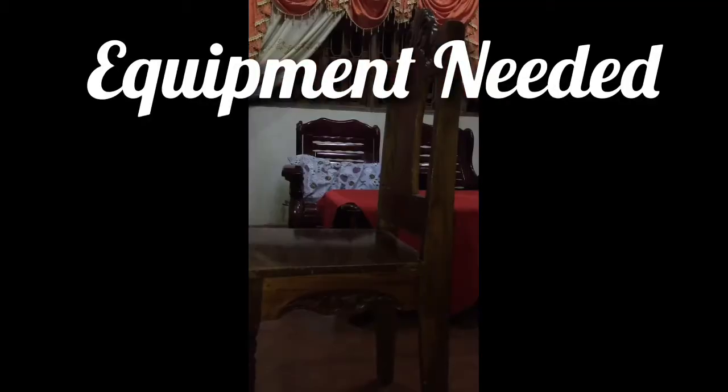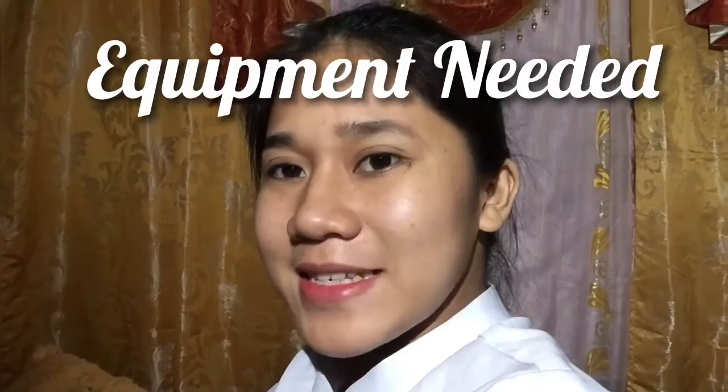The purpose of helping the client to transfer from bed to chair or wheelchair is to help the client to move from one place to another. Another purpose is to reposition the client. Another thing, wheelchairs are used by people for whom walking is difficult or impossible due to illness, injury, or disability. Equipment: transfer belt, chair or wheelchair, and other assistive devices.